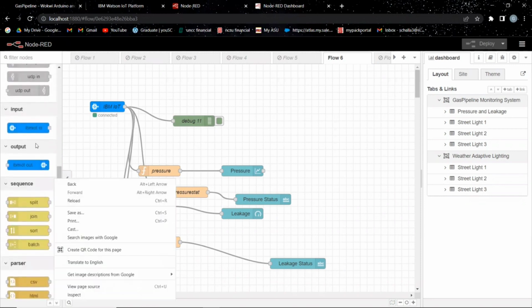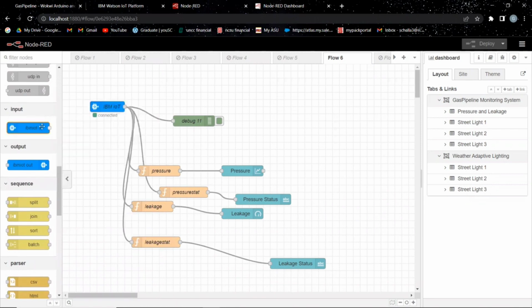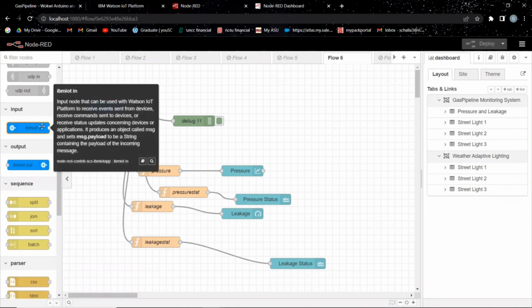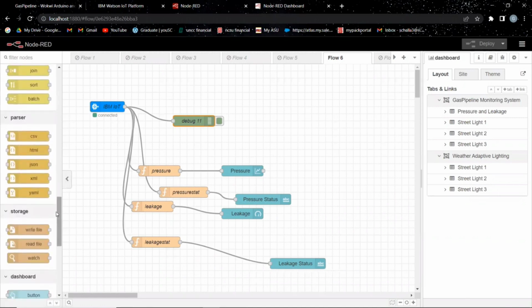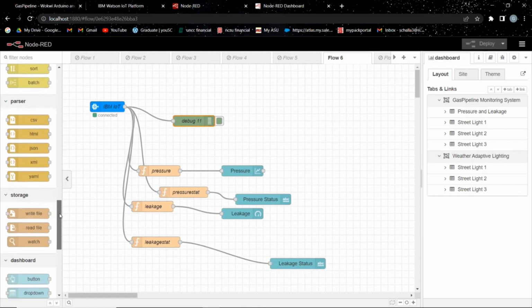So go to the IBM nodes and click on IBM IoT in node, since we are sending in the events from the Wokwi device. Got the IBM IoT. So now connect this node to the debug node, which is generally used for showing the debug messages. And then add, since we will be showing the pressure and gas leakage values and also the alert messages to the staff, we will be making use of four functions, two functions belonging to each statistic. So two functions for pressure and two functions for leakage.